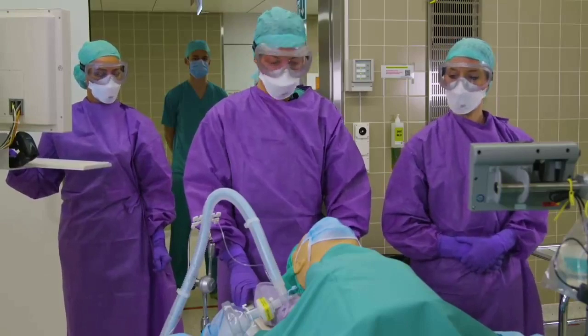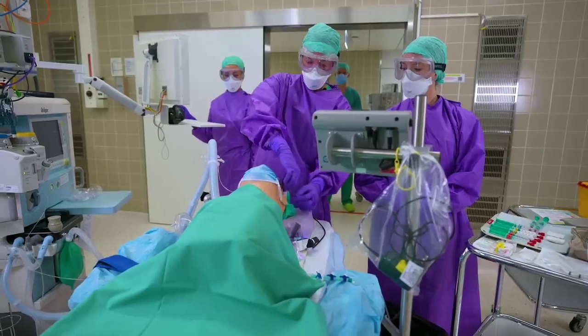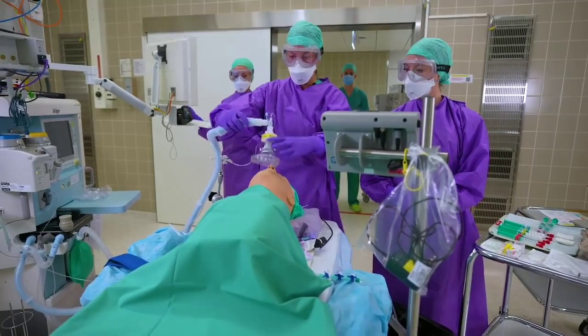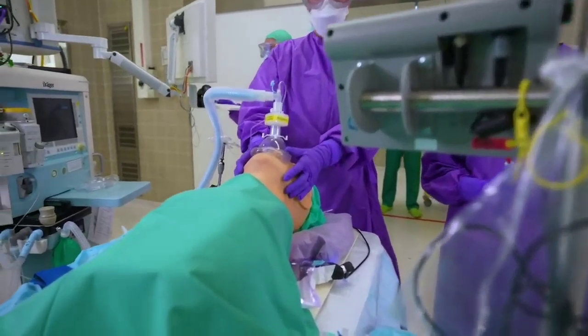We are starting with an adequate pre-oxygenation for about three to five minutes. As you can see, our patient is wearing a surgical face mask, which we have to take off. Then we will pre-oxygenate, and here it's important to have a tight-fitting mask to avoid any leakage.